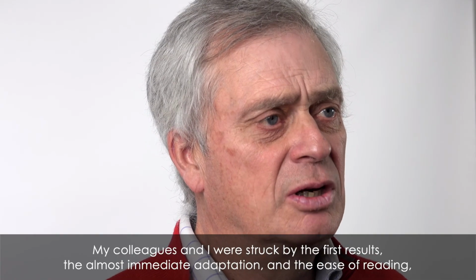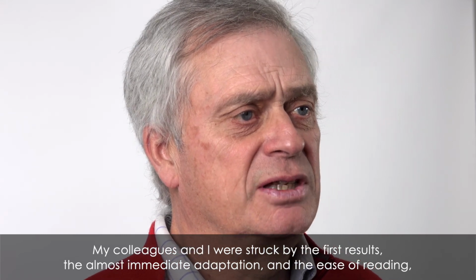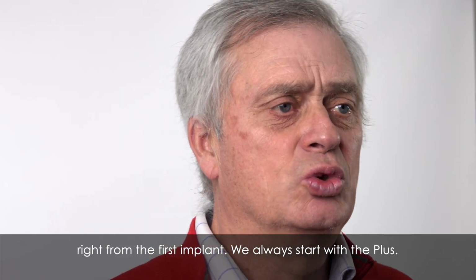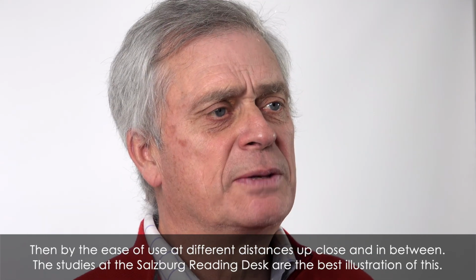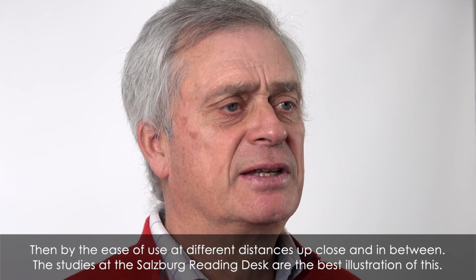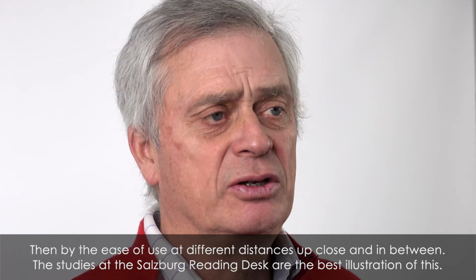My colleagues and I were struck by the first results, the almost immediate adaptation and the ease of reading right from the first implant. We always start with the PLUS. Then, by the ease of use at different distances, up close and in between. The studies at the Salzburg Reading Desk are the best illustration of this.